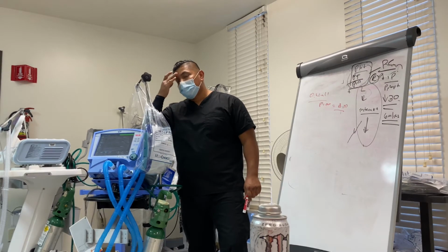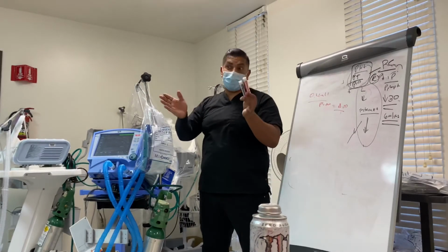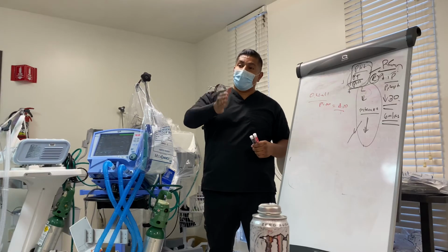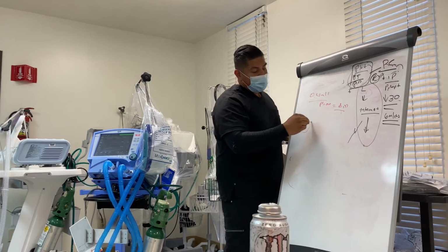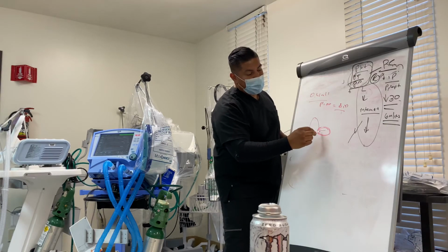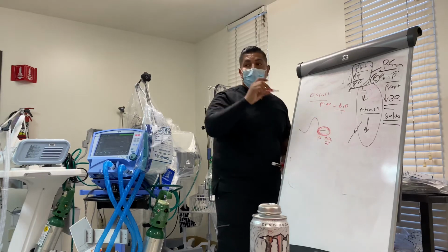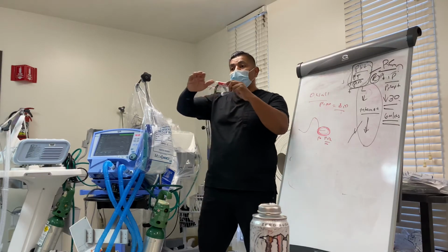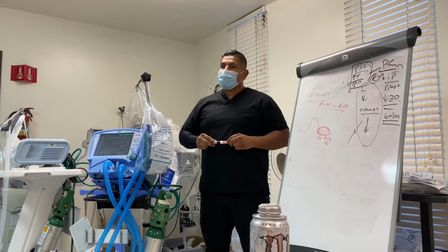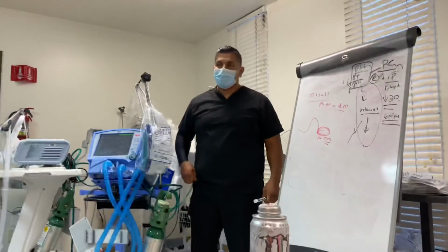And we should start at 1. Yes. Aim for an IE ratio that's between 1 to 2, 1 to 3 normally. You want to avoid I times less than 0.8, because you want this pause there, which is what holds your pressure and improves your oxygenation. If you don't have that pause, your pressure or volume's not going to be held and met, and you're not going to help with oxygenation. Right, and that decreased I time is causing me not to meet tidal volumes. Exactly.